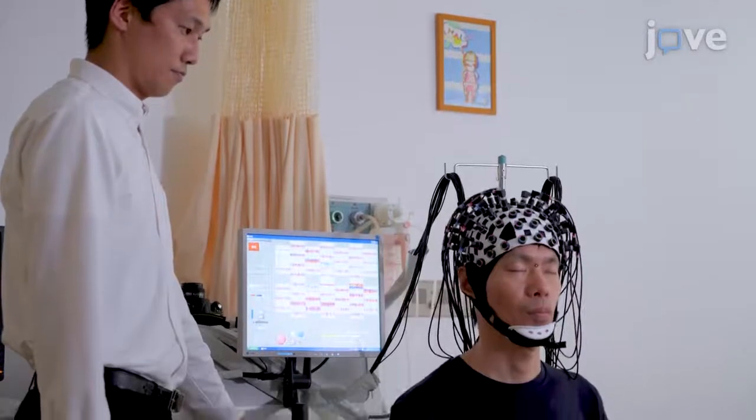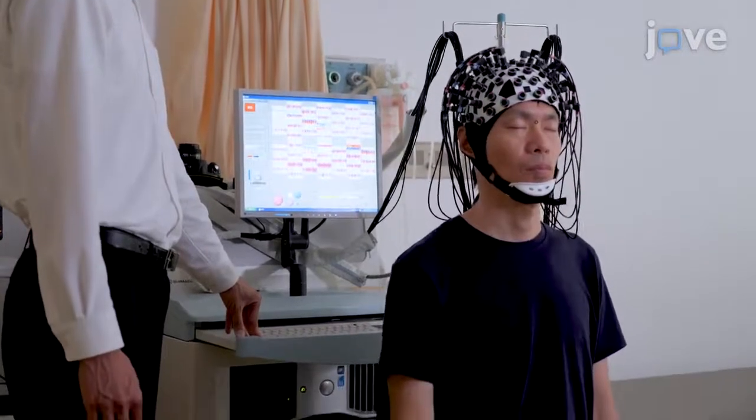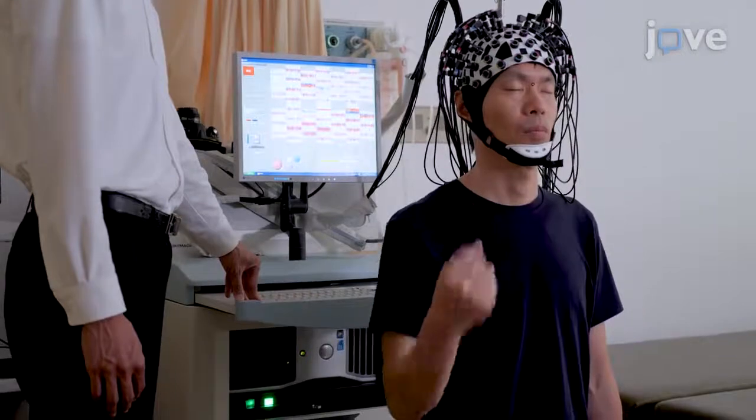The interpretation of fNIRS data can be difficult for novice users, as the data usually cannot be quantified. Our protocol using two complementary methods provides a better understanding of this data.